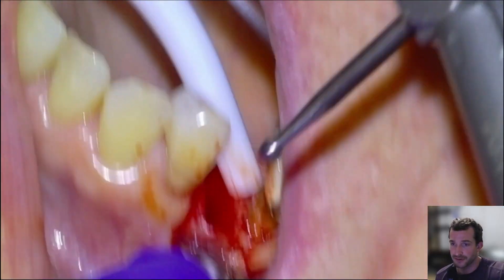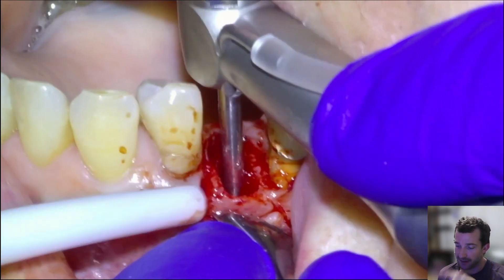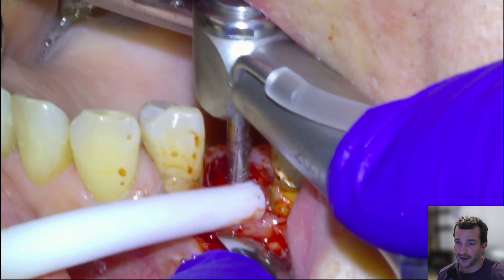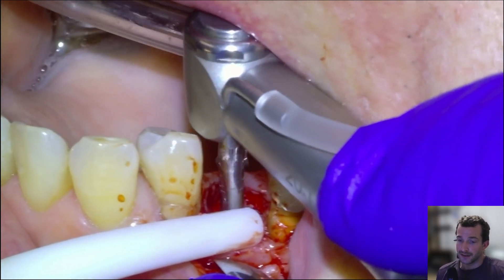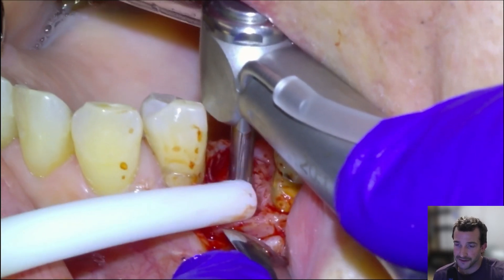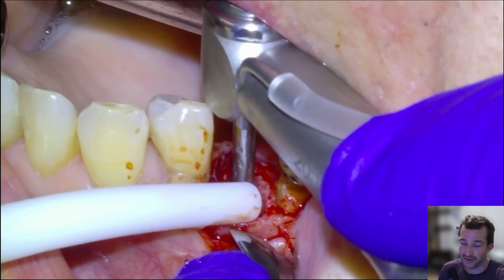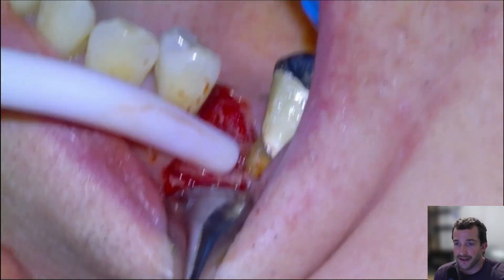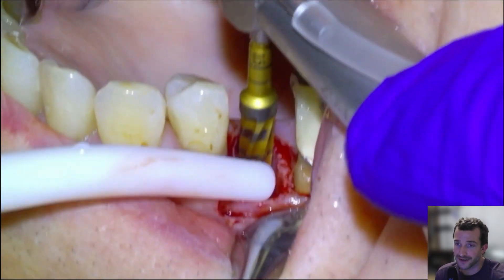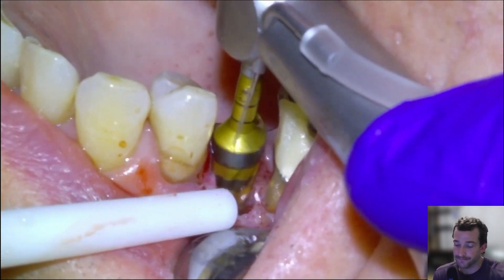Now we're going to get started with our osteotomy. Because the lamina dura that anchors the root is dense bone, I usually like to punch through it with a round carbide burr on the implant handpiece, just to perforate through the lamina dura — always doing it on the lingual aspect of the socket so there is a good buccal gap that can fill in with new bone and the buccal plate thickens up. For immediate implants I'll typically use a longer length and I like 4.8 millimeter diameters for single-rooted teeth, unless it's an upper lateral or a lower incisor.